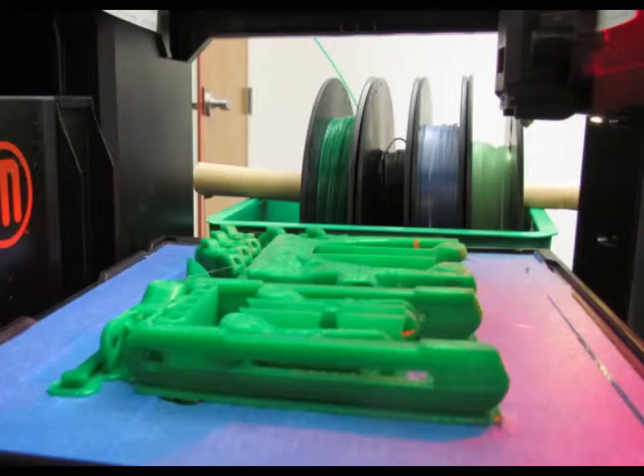So the first step, of course, is to print out the 3D parts. Now, we didn't have a 3D printer here, so we got someone else to print it for us. And the process looks like this.